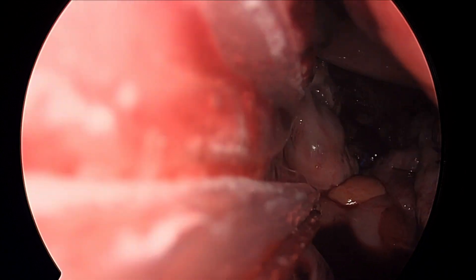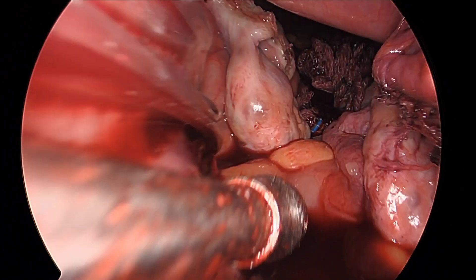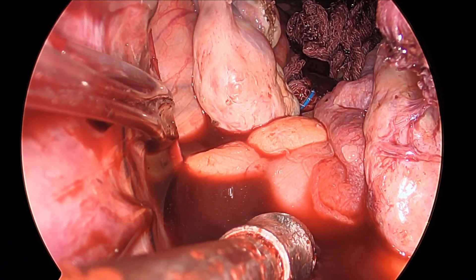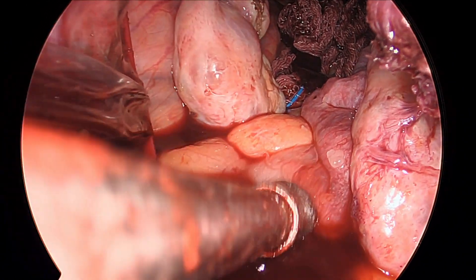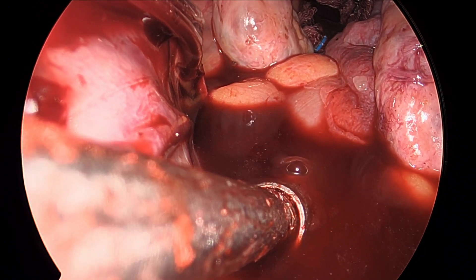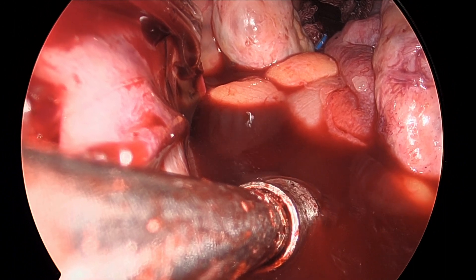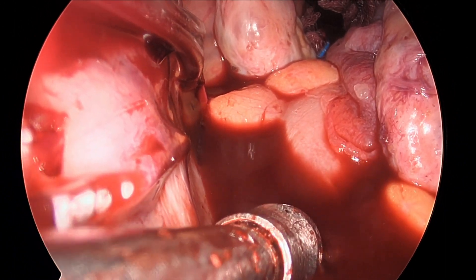However, if suction is needed, a Yankauer suction used vaginally in open cases is introduced through one of the ports while the suction tubing is clamped to avoid loss of pneumoperitoneum. Once the tip is in the intended location, suction is then intermittently clamped and unclamped to suction the blood while avoiding loss of pneumoperitoneum.